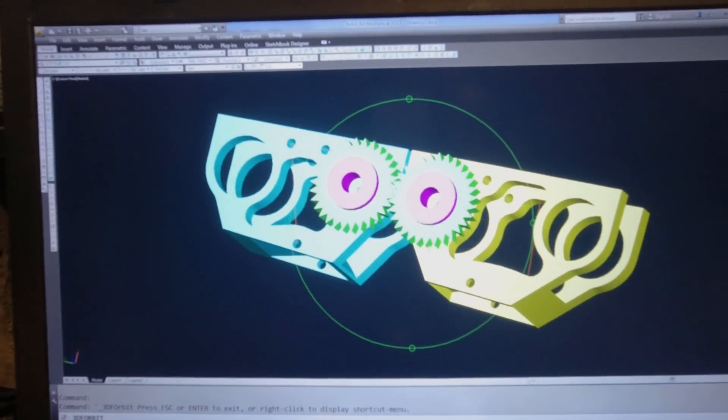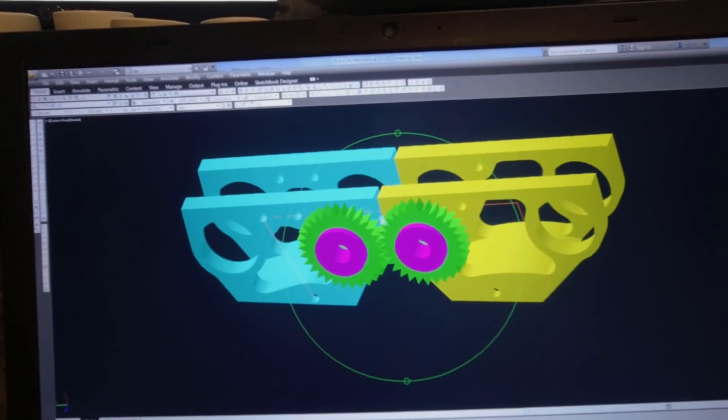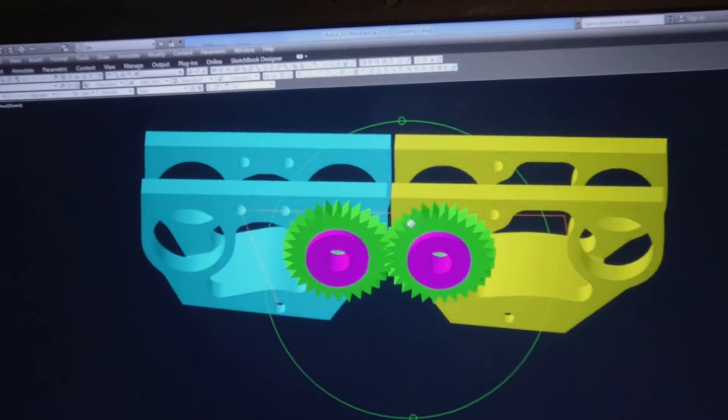The gears press into the 3/8 bearing bores of the finger sections. The gear also has a quarter-inch bore that a smaller flange bearing presses into. This change meant that I also needed to remake the axles that hold the fingers together.